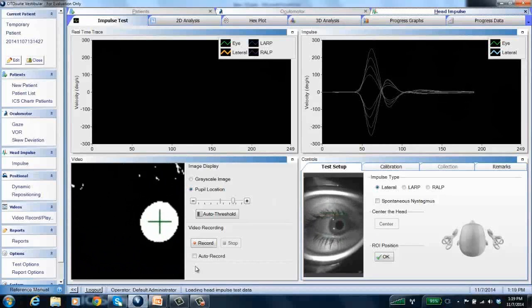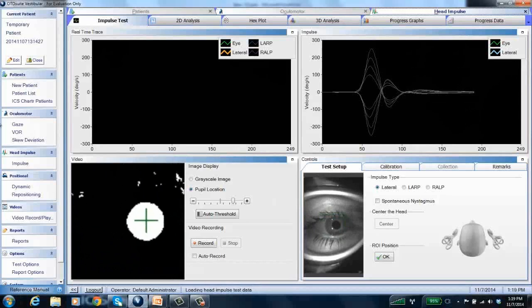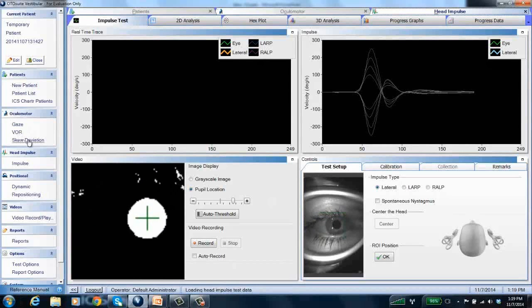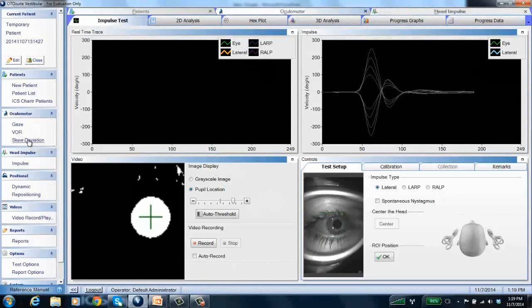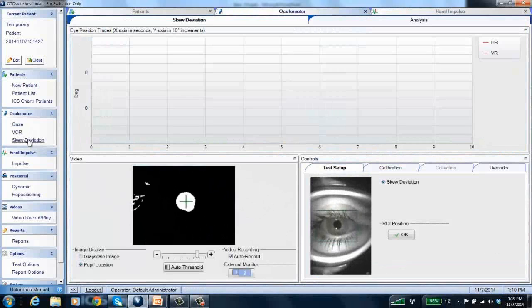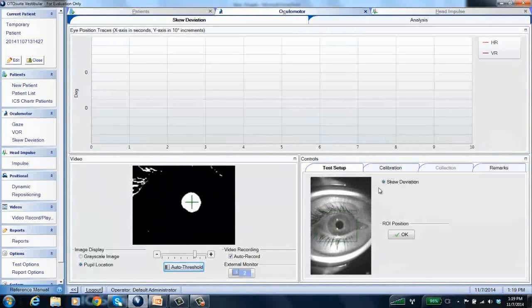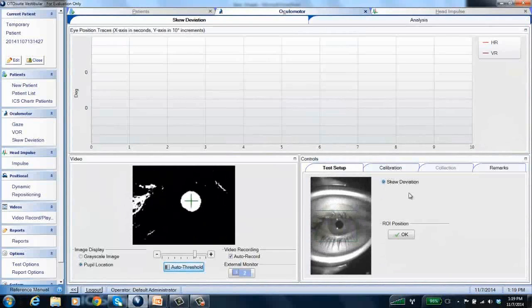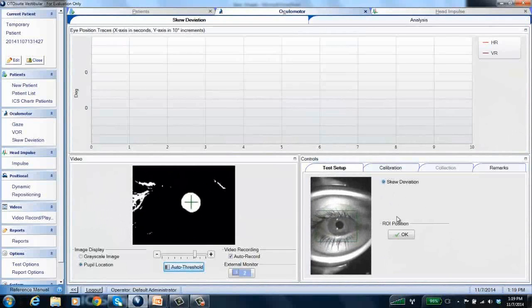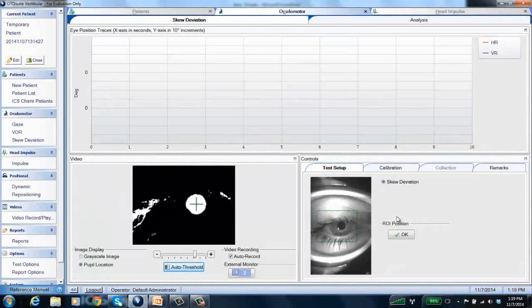So if you want to do a skew deviation test, you need to come over to the navigation panel on the left and choose skew deviation. As you can see, there's only one option for skew deviation and there's no drop-down, so everything's ready for your test to begin.